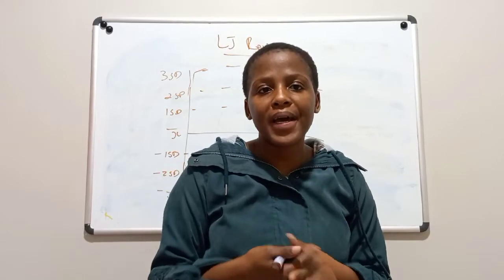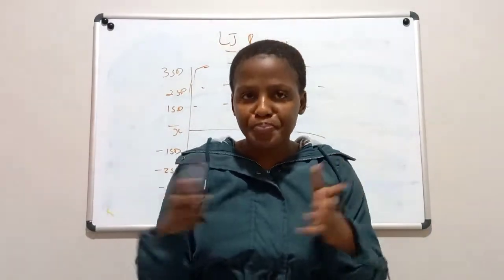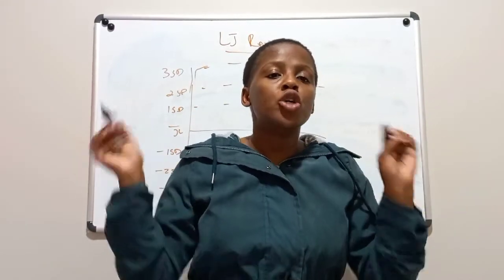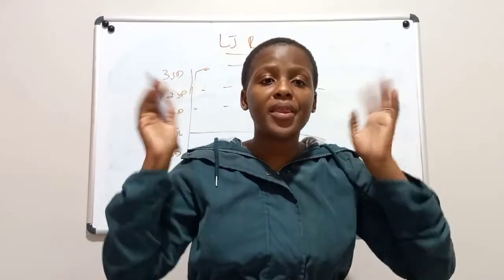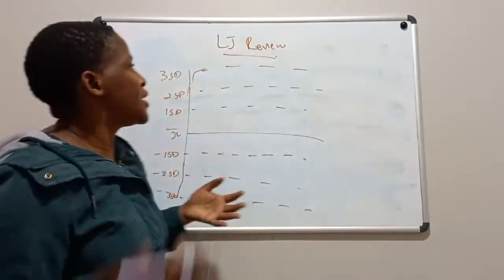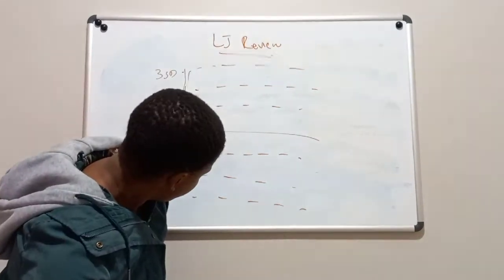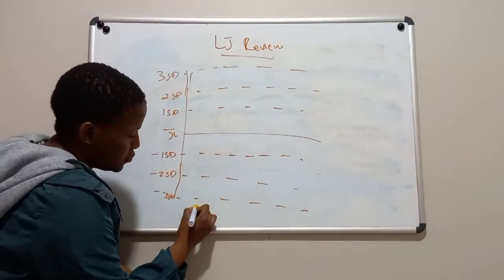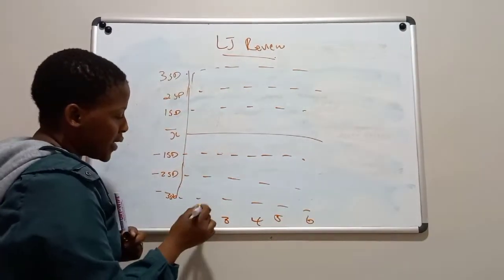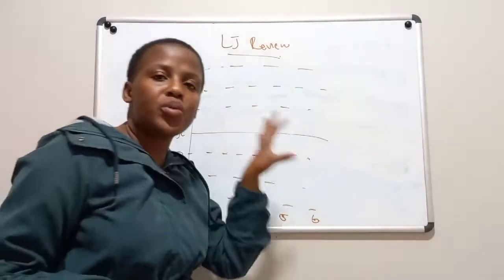Outliers are when a point is outside, depending on the rules of the laboratory. Usually Westgard uses a 3SD range, so we're going to follow that. In this case, an outlier will be a point that is outside a 3SD range. Let's say we have a point here, which is outside the minus 3SD. So it is outside the 3SD range, and we will indicate that it is an outlier. We see this on a daily basis as we run QC samples.